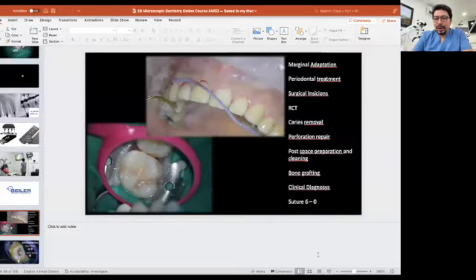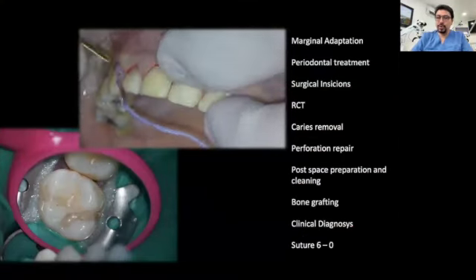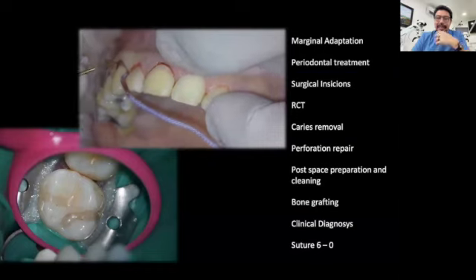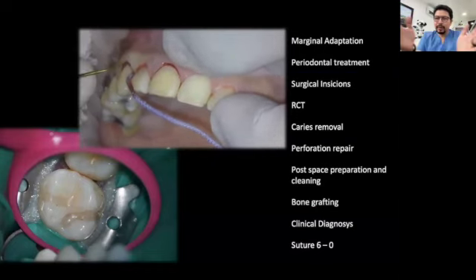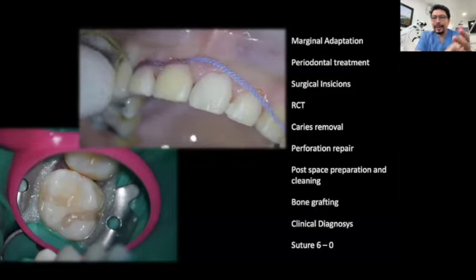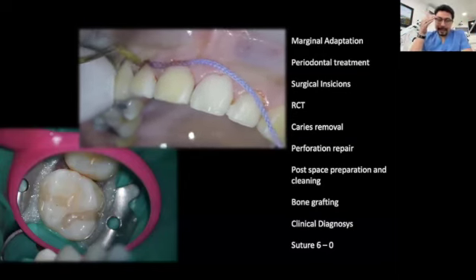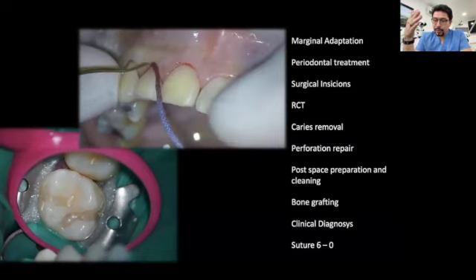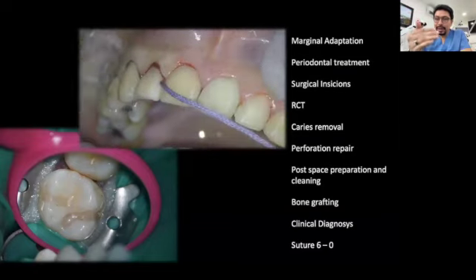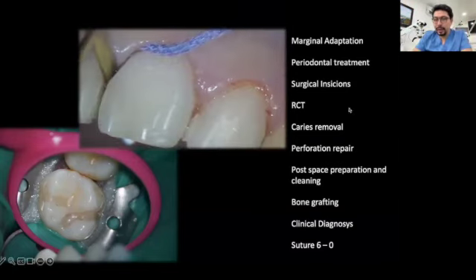Okay, guys, we are almost just in time. As I mentioned to you, that video is like a resume of many things that we have been talking about. That video has some clinical tips and tricks. It's around 12 minutes long, but I wanted to mention to you personally the importance of understanding where to place the mirror, and that when you detect where you need to place the mirror, don't move it. Keep it in that position and just angulate the mirror for trying to obtain a proper vision in the specific area in which you are working.